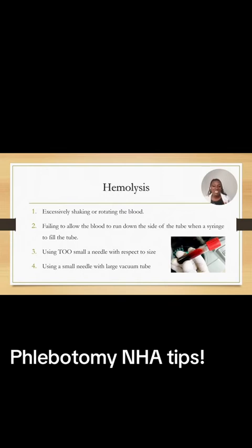Now, questions that they may ask you are based on these topics right here. Excessively shaking or rotating the blood, right? We want to gently invert the blood in additives. So we're going like this, or we're doing it in an infinity sign, whatever. But we are not shaking it up to break down the red blood cells. That is not what we want.